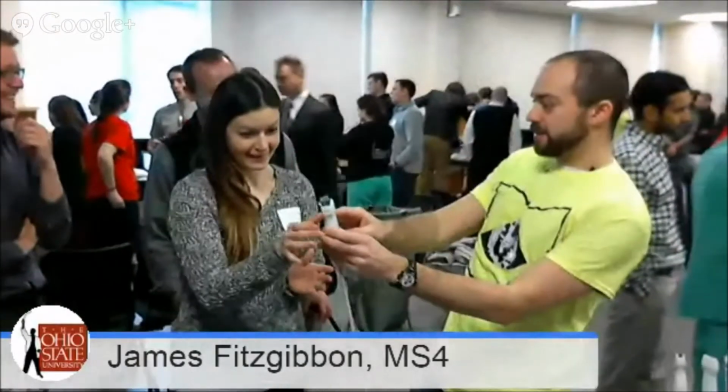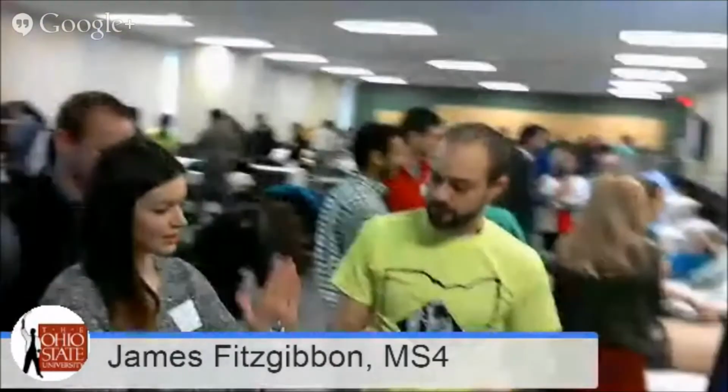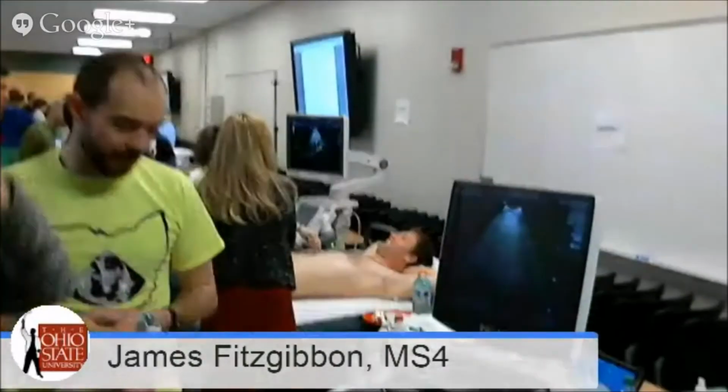Okay, it's okay. What's your name? I'm sorry. Brennan. Brendan and Denise. So, being pro people, there's this knob on the side. Feel that? That's corresponding to this edge. So notice if you touch right here on the probe, you can always check which side your leading edge is. Yep, you got it.